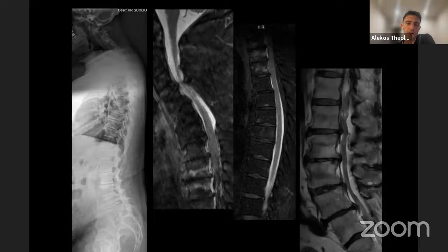This is another gentleman, pretty complex history, prior isolated cervical laminectomy. As you can see there, he developed cervical kyphosis, post-laminectomy kyphosis, and then has new adjacent segment stenosis at 3-4, as well as multi-level disease and stenosis into the upper thoracic spine down to about T7. And then you can see his very significant stenosis in the lumbar spine. The combination of a cervical myelopathy plus maybe even a superimposed thoracic or lumbar thoracic myelopathy and also lumbar stenosis. So this guy was debilitated in many different ways.